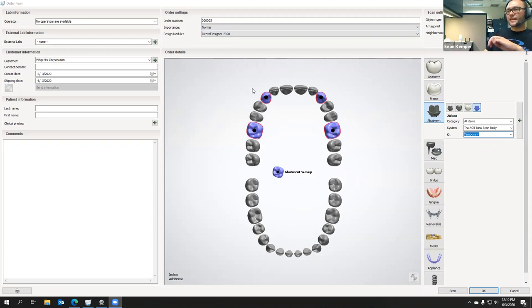So just recapping, what I actually did was opened the order form and then selected my teeth and then clicked abutment and then wax up abutment. And then what we were talking about with True Abutment, they have a option here for temporary, which is going to put the screw retention in the actual design. So you don't need a tie base, but that would be like if you're milling it in PMMA, not really recommended for the final restoration or prosthetic. These other two options, or other eight options, are either a short or long tie base, and then giving you a variable cement gap, which is nice because a lot of companies don't offer that kind of an option. It's all just one option that's set.